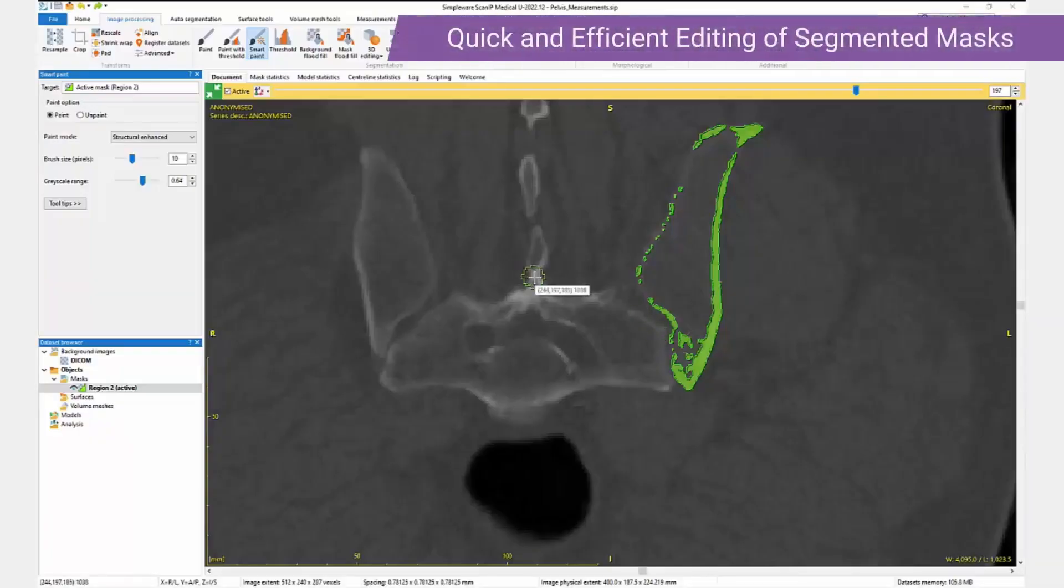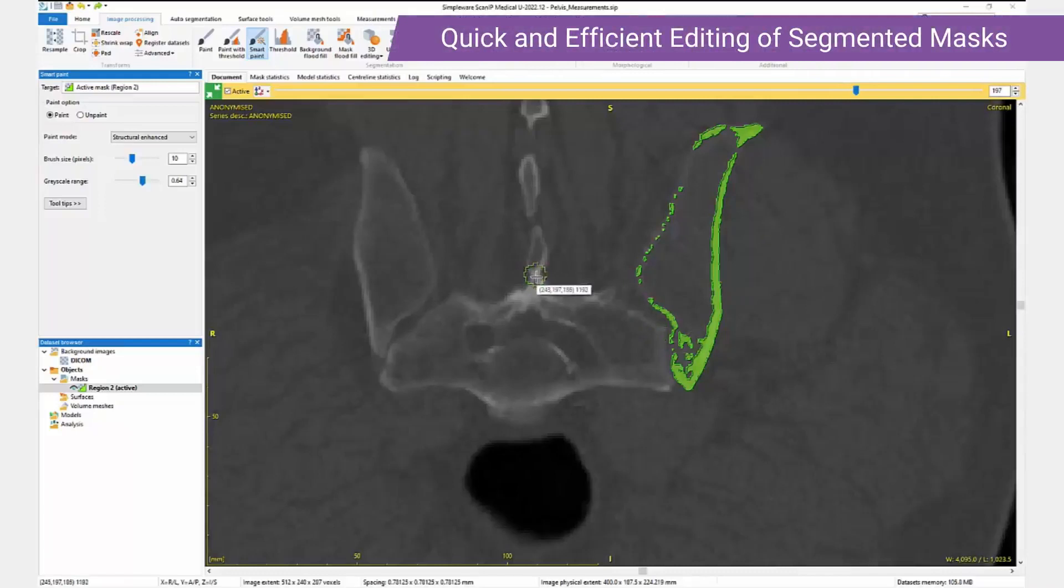This is the new SmartPaint tool, which allows for quick and efficient editing of segmented masks which have been generated by a threshold, for example when doing bone segmentation.